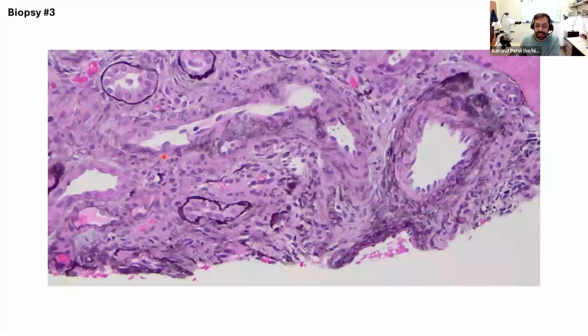And then I'm going to go into some of the vessels, and I'm starting with a relatively normal vessel for some comparison before we start looking at vascular abnormalities. What I want to see in a normal arterial vessel is a nice flat endothelium, a thin intima with a flat endothelium. These endothelial cells are a little bit pooched in and swollen looking, but under that we want to have an intact smooth muscle layer making up the media.